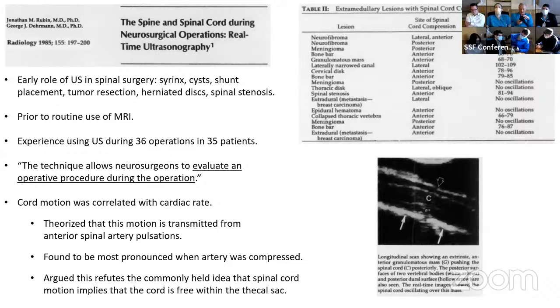And our good friend Dr. Maximino Tellez-Guts again identifies how nice it is to have two modalities, ultrasound and neurophysiologic monitoring. In terms of sensitivity and specificity, where would you place ultrasound versus intraoperative monitoring?